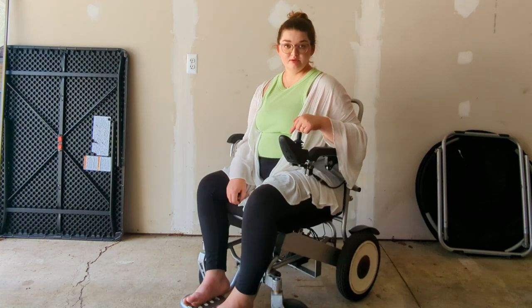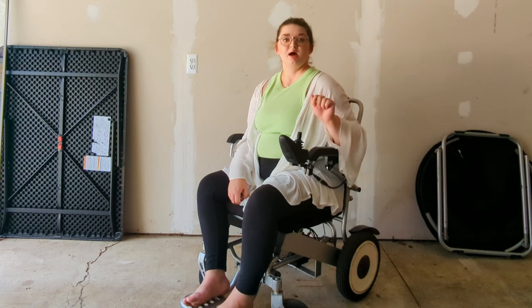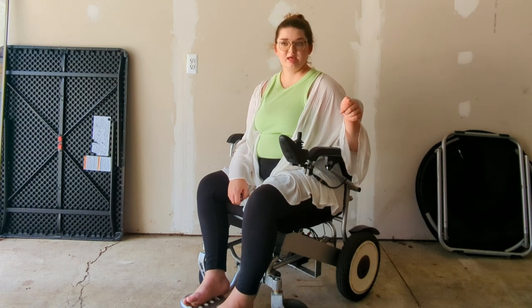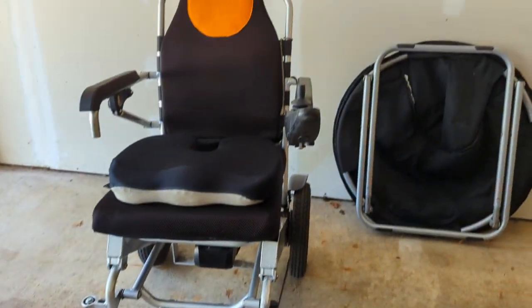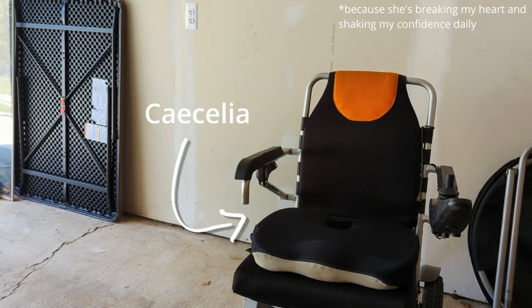I'm going to get out of the chair now so I can show you some of the other components on the bottom, like the battery and how it folds. Here she is in her glory without me in her. Her name is Cecilia. Say hi.